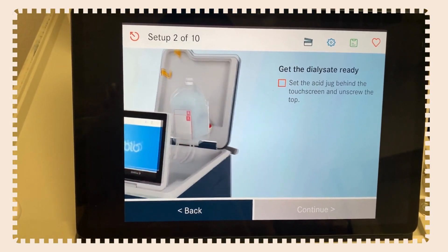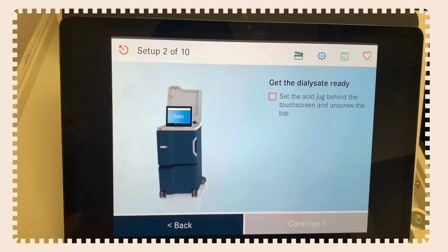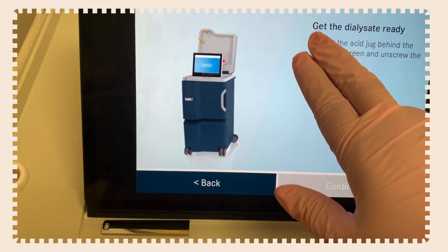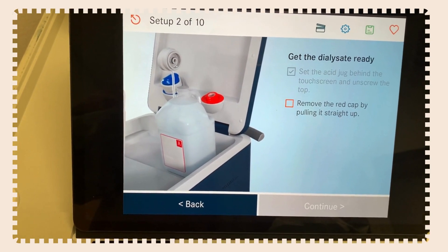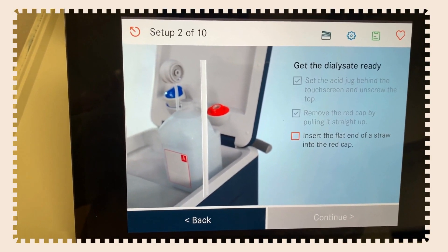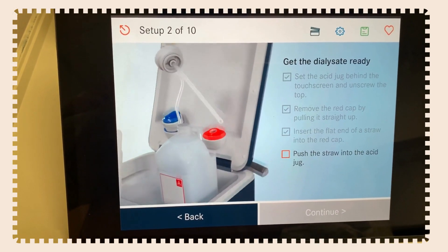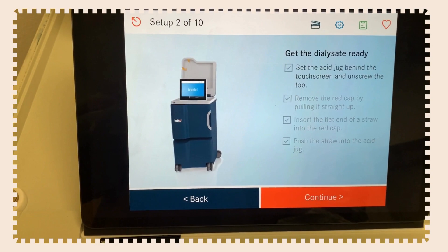Get the dialysate ready. Set the acid jug behind the touchscreen and unscrew the top. Remove the red cap by pulling it straight up. Then insert the flat end of a straw into the red cap — the straw comes with the machine — and push it into the jug. There is a silver film across the top that you have to push through.